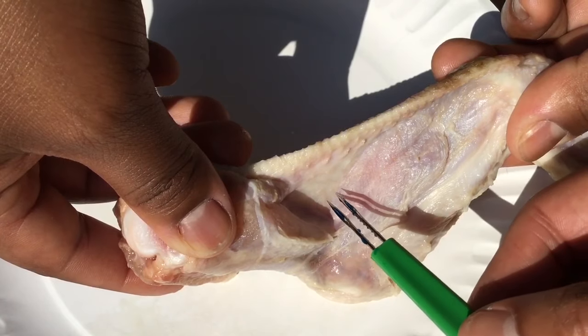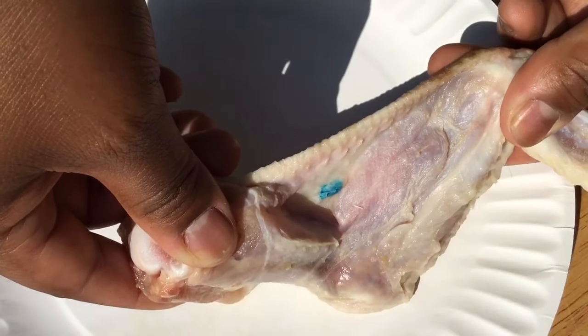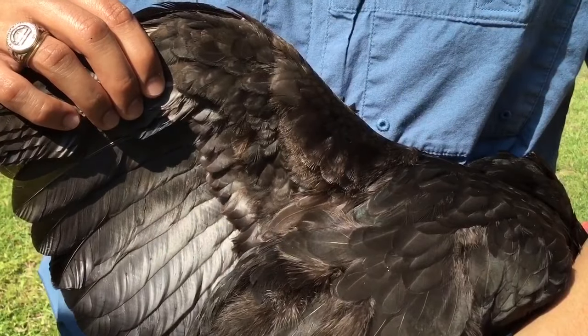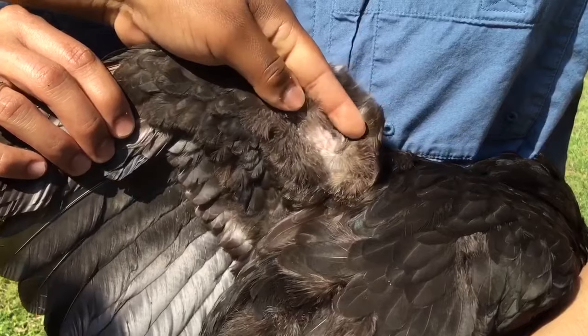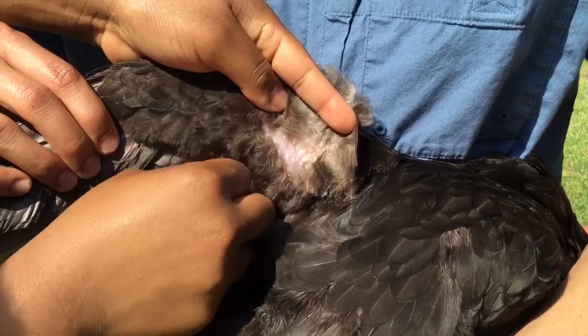The blue dye left behind on the skin surface allows you to see which of your chickens have already been vaccinated. Pluck a few of the smaller feathers in the wing web in order to allow your vaccine to come in direct contact with the skin surface.